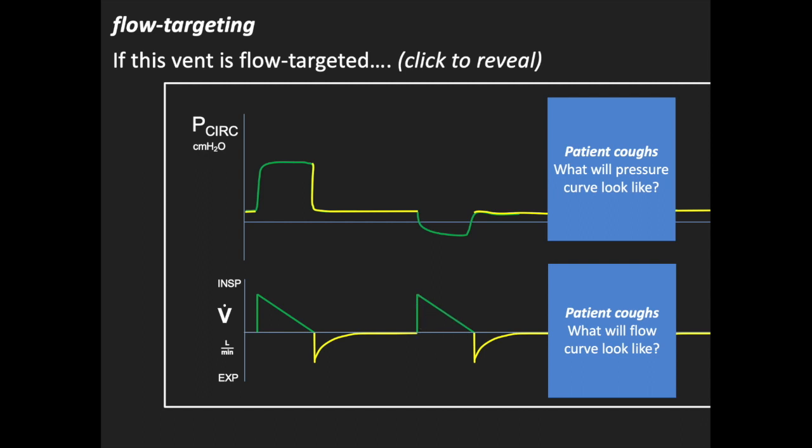Remember I said that I'd say a little bit about how you could tell if a patient was trying to breathe too hard or if you weren't providing enough support even though you see A on the trigger. Well, this is one of those situations. Right here, the patient is trying to breathe in much harder than this flow curve is allowing. The ventilator is not letting the patient breathe in any faster, and as a result, the patient is sucking really hard on the tube and dropping the pressure low.